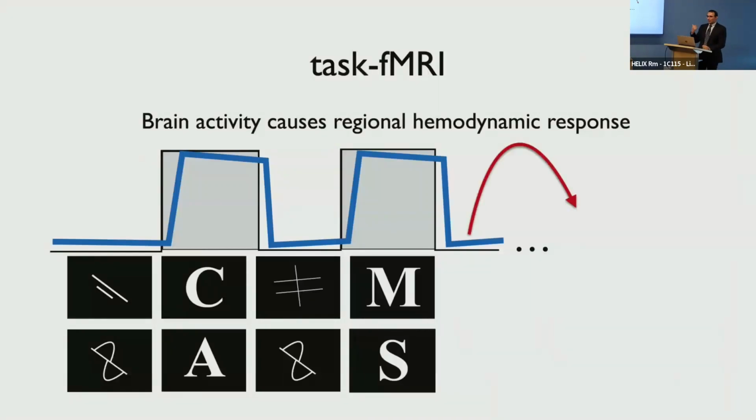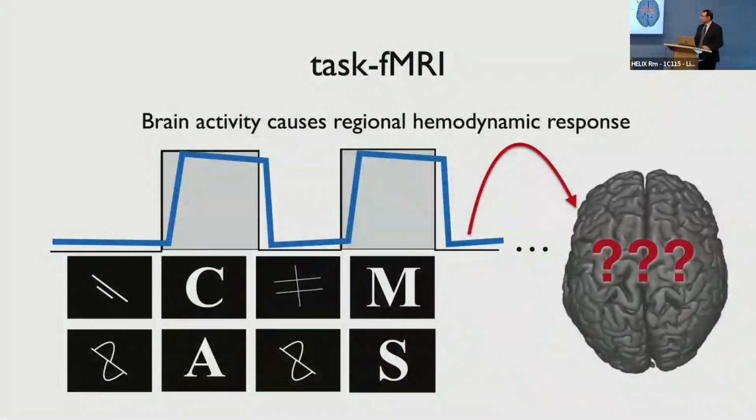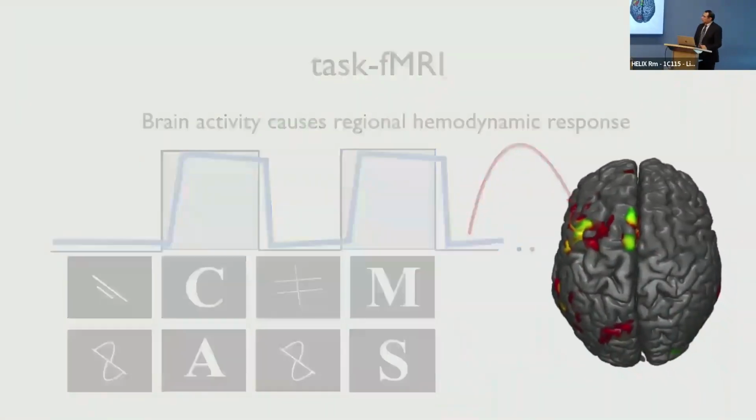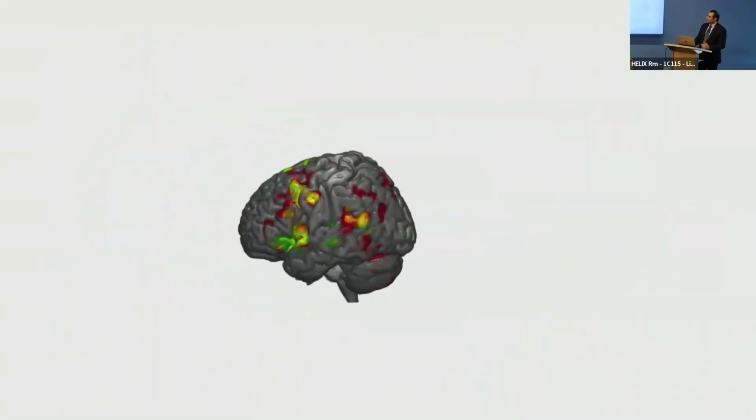So you map that back onto the brain and get these kinds of images showing which specific regions had this modulation when somebody was thinking about language. When you look at these sets of images, these are some of the classic areas of language activation, like Broca and Wernicke, and some dorsolateral prefrontal cortex activation, which I think many people are familiar with.